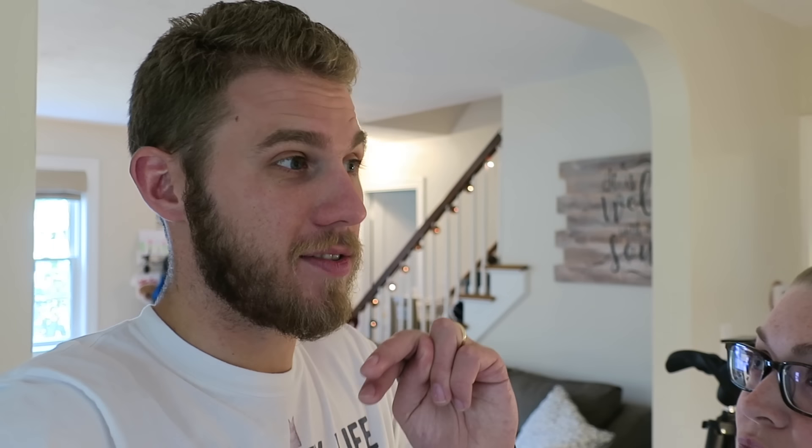I'm having some sugar before because my blood sugar's dropping. Before I went in to have my feeding tube switched out for the first time, I went on YouTube and looked for feeding tube button change-out because I wanted to see what it was like — so if you're getting ready to change your own at home for the first time, there you go. This is Mary's second, or actually her third button. She got one in surgery and then the surgeon changed it in the office, and we barely caught that on camera. It is really quick, so don't blink.